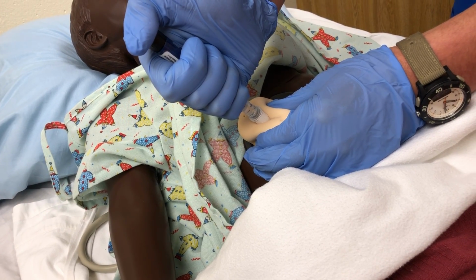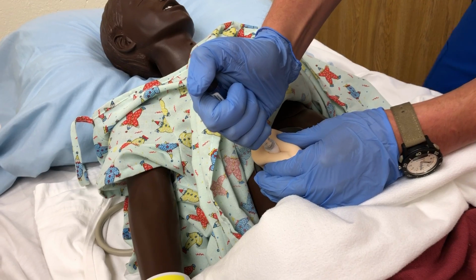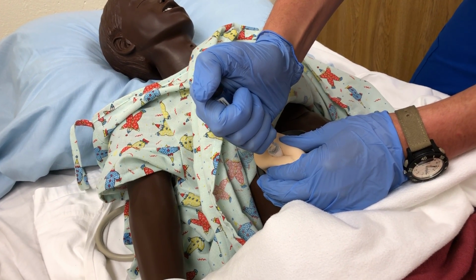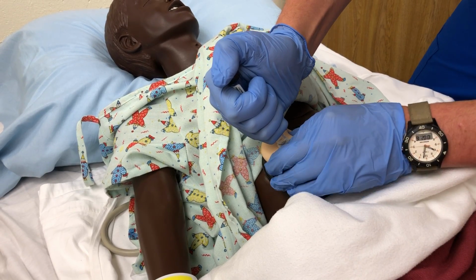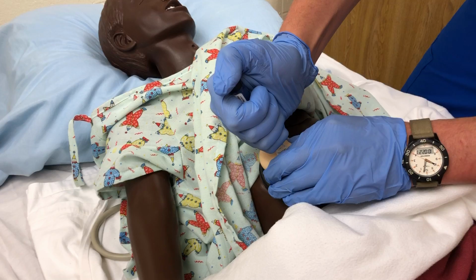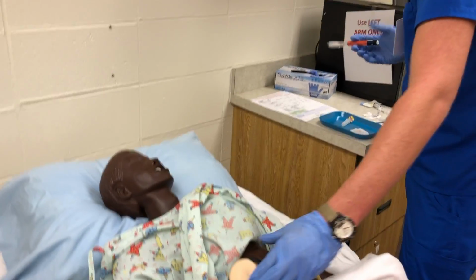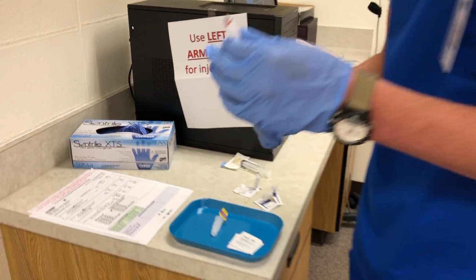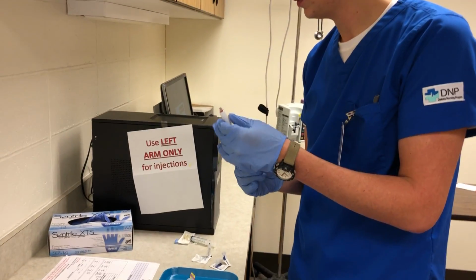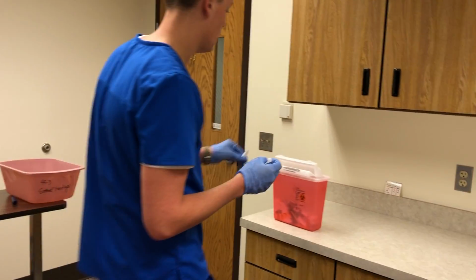And then we're gonna hold it there for 10 seconds, because these can sometimes squirt back out if not held. Okay, so there's 10 seconds, and I can pull back and release. And since I used that, the safety is engaged, so then I can just screw off and throw these away.